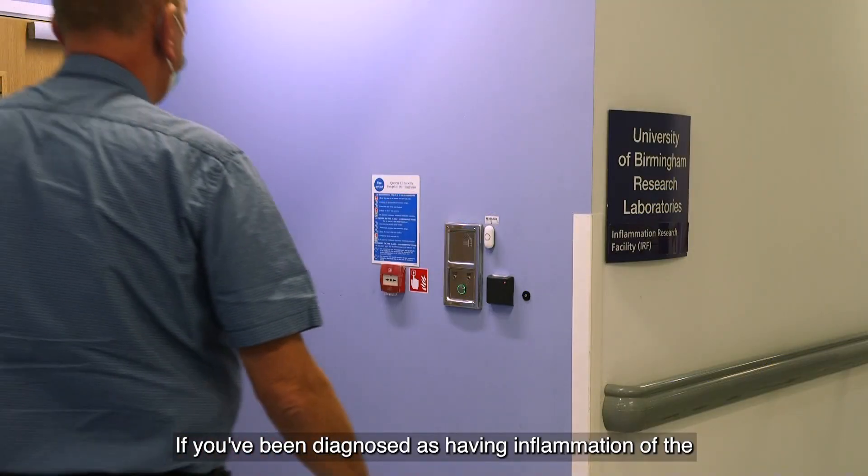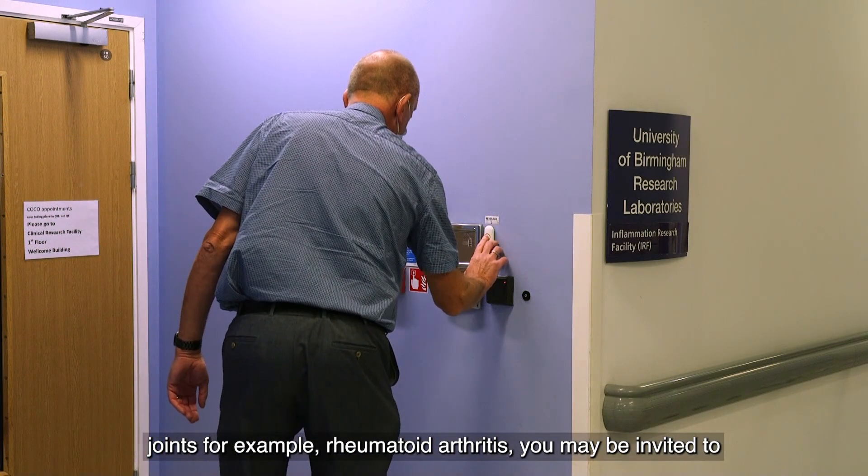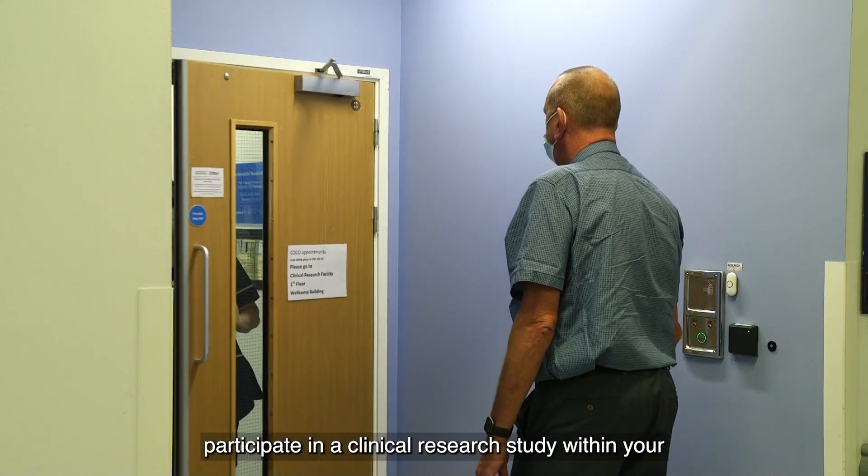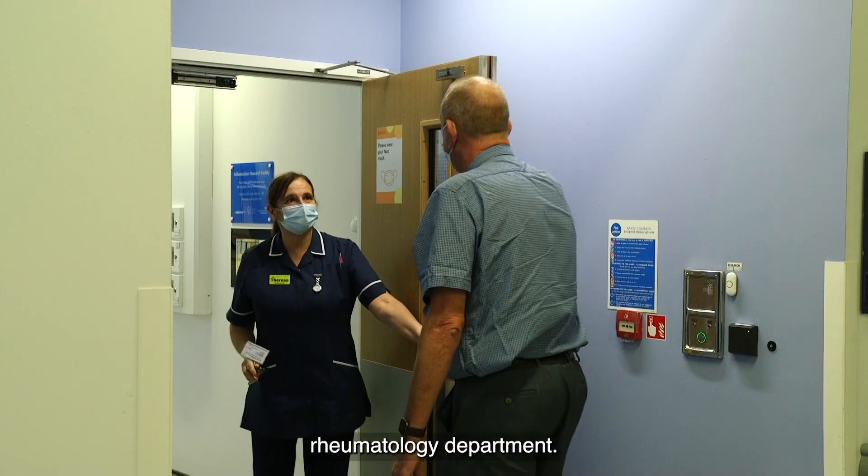If you've been diagnosed as having inflammation of the joints, for example rheumatoid arthritis, you may be invited to participate in a clinical research study within your rheumatology department.